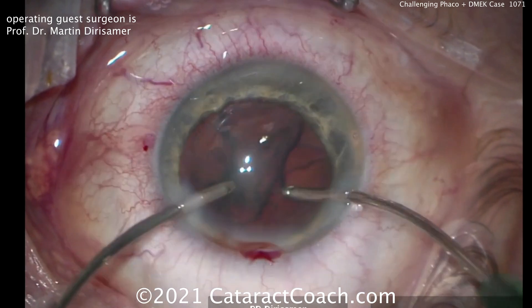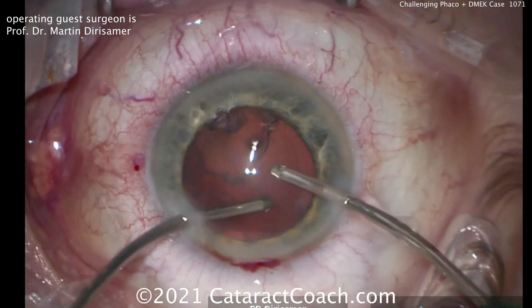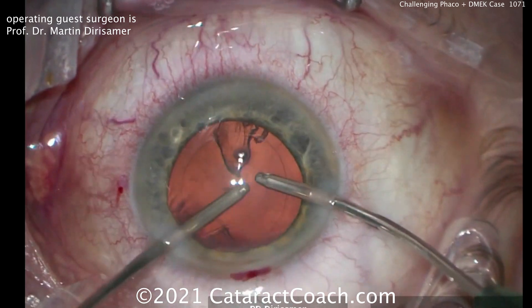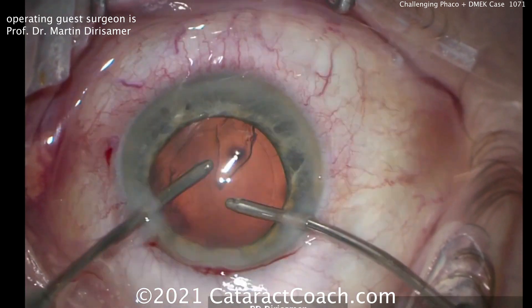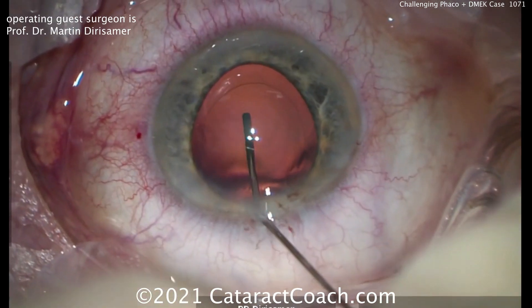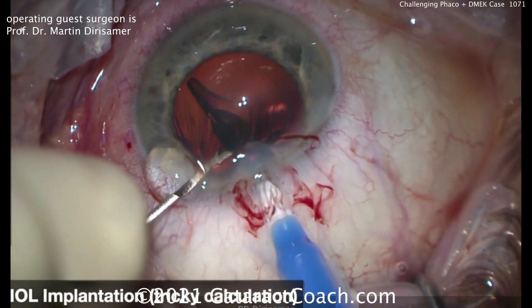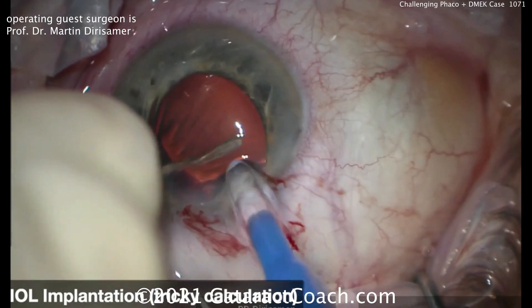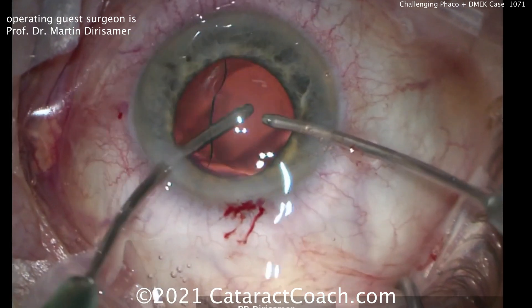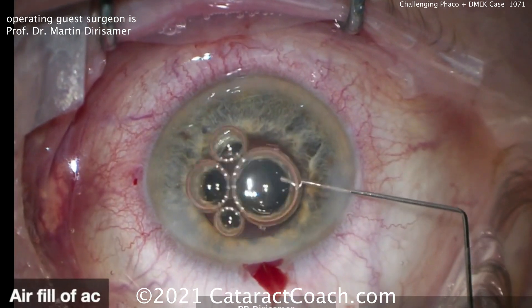In a post-LASIK eye, even without corneal issues, lens calculations are different. Adding DSAEK or DMEK on top of that means we have to aim even a little more for post-op myopia — more so for DSAEK, but also relevant for DMEK. There's the filling of the capsular bag and a nice capsulorhexis. The IOL is going right in the capsular bag — a four-haptic or plate-haptic style lens stays in the bag very well.